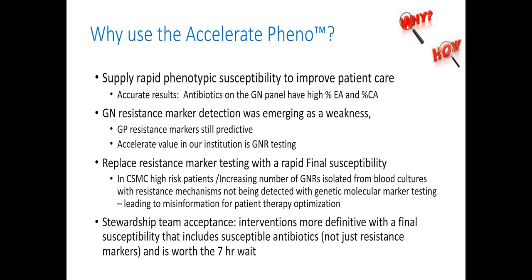The accuracy of this claim is in numerous studies, and it was cited in my talk that I just gave, that it's 99.6% positive predictive value with a gram stain interpretation and 97.8% positive predictive value without a gram stain.